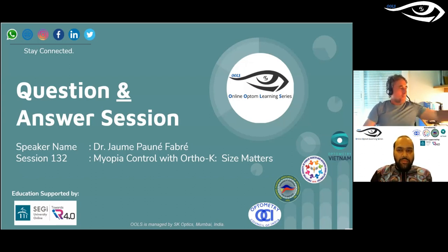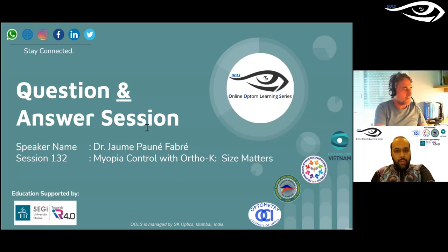Okay. Today, CRT has a 5mm optical zone. It is already commercially available. It is one of the lenses that sells most in the world. You have DRL, my design in Malaysia. You have that lens available through Stanley Sachs in Singapore, if you want this. So you can use that. There are other designs, Emerald, and other designs where you can change the optical zone of the lens, of course.